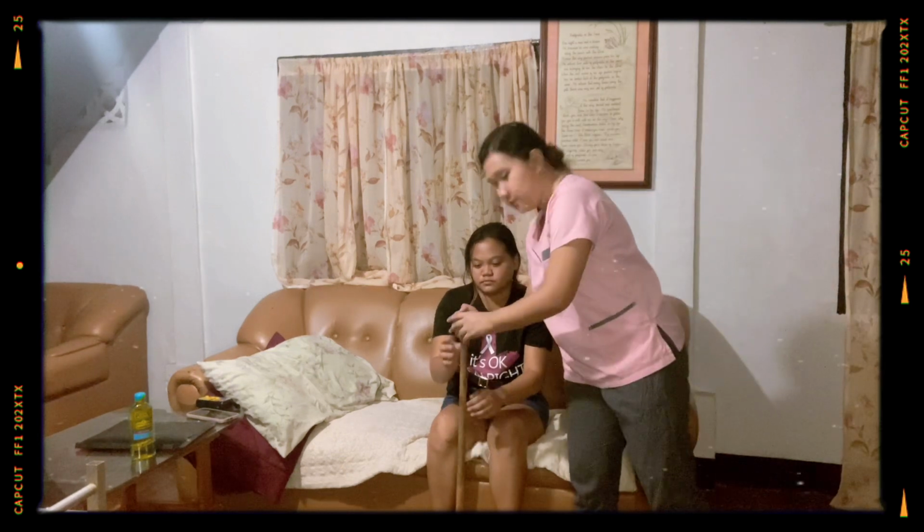So for procedure number 6, encourage the patient to make use of the stand assist device to stand with weight evenly distributed between the feet and the cane. So this is to aid the patient's maintenance of balance. Now I'm going to let the patient hold it. So hold, ma'am, like this, ma'am.